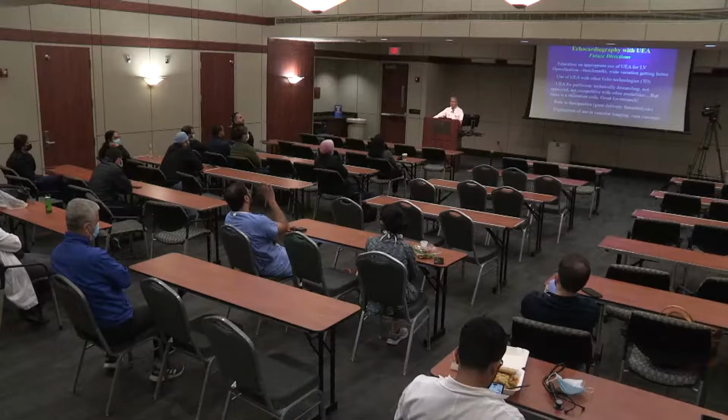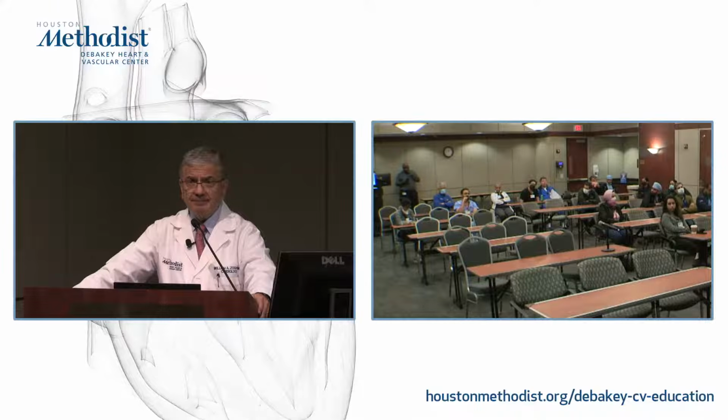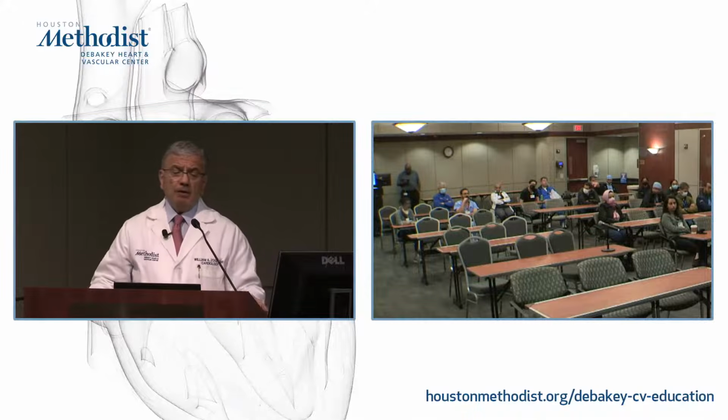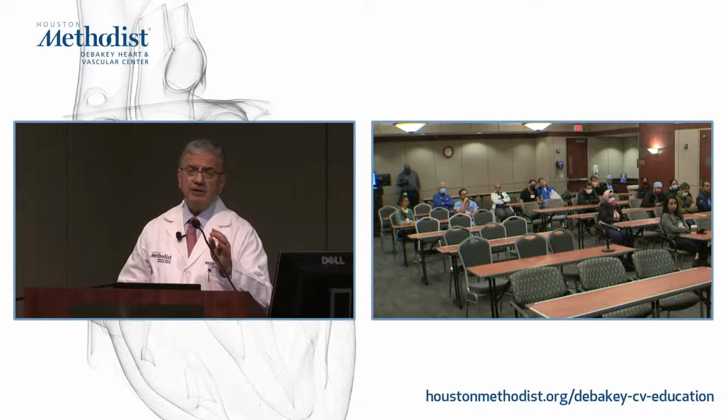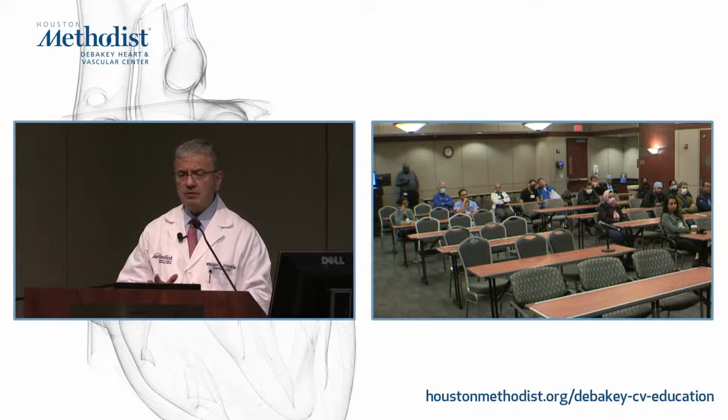Other questions? Dr. Zoghbi. Yes. So the contrast, would that influence the measurement for the LV quantification, or if we have a decent non-contrast, should we go for that for the LV? The question is, with contrast, how does it change your measurements, et cetera. We know that with non-contrast images, ventricular size, probably not as much function, because ventricular size, diastole and systole, is smaller than any other CT or MR imaging.